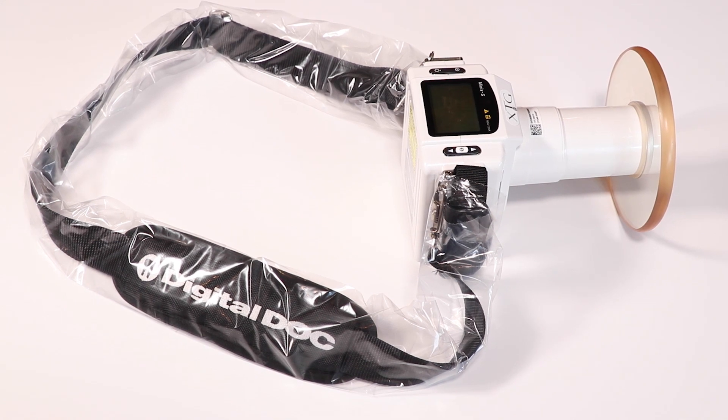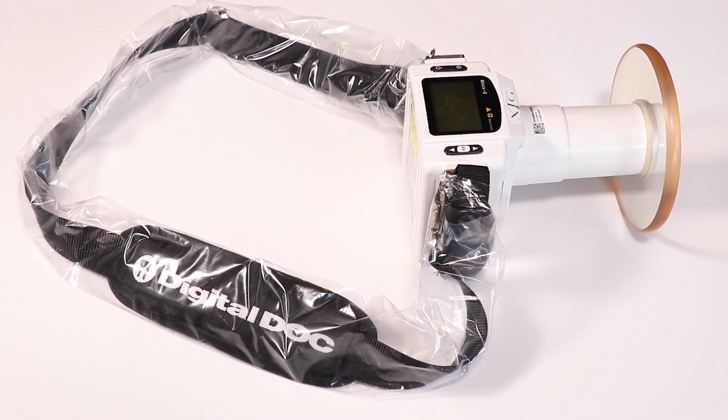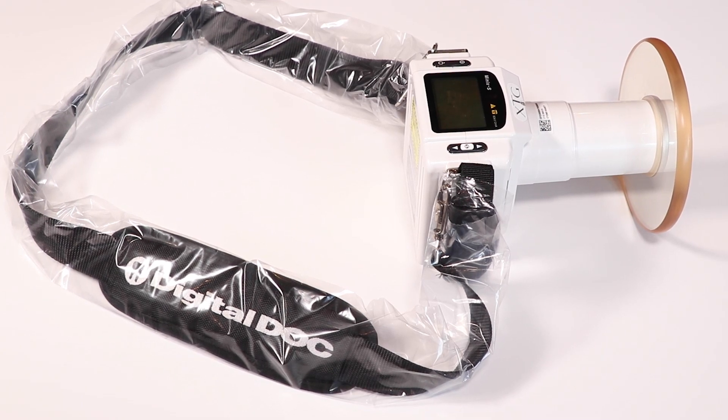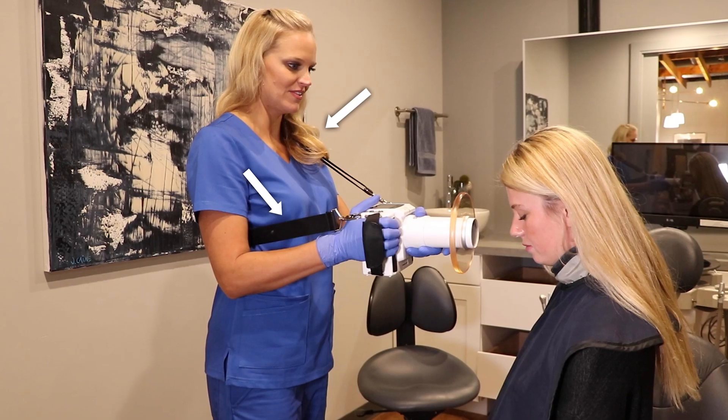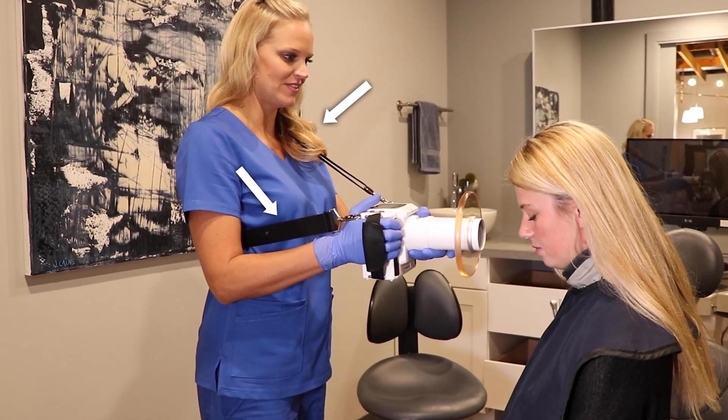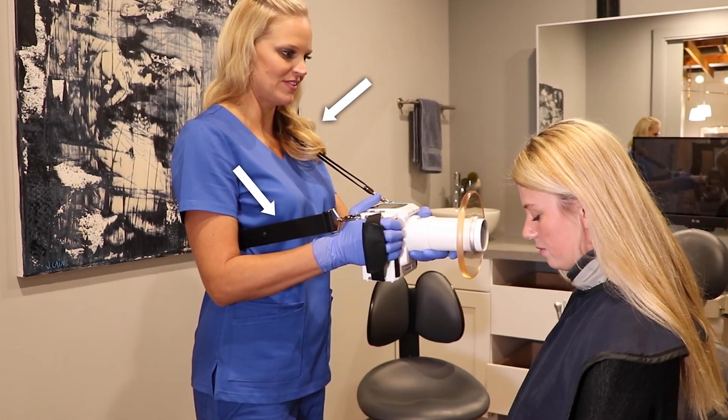The shoulder strap allows the operator to take an x-ray and adjust the sensor without putting the x-ray down, saving you time. The unit, when worn cross shoulder, distributes the weight throughout your back, making it lightweight and reducing operator fatigue.